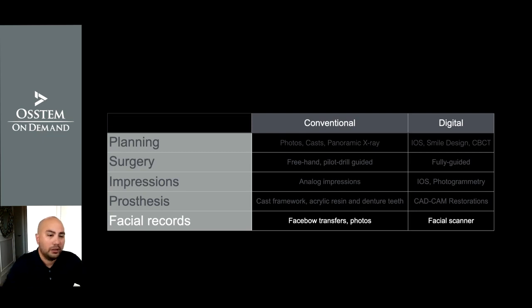Now let's focus our discussion on facial records, which is conventionally done with facebow transfers and photos, and then more recently with digital techniques with a facial scanner.